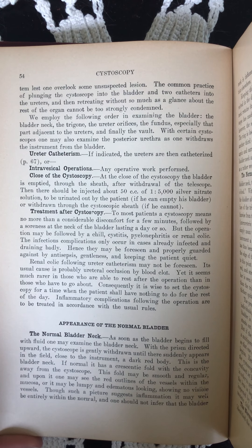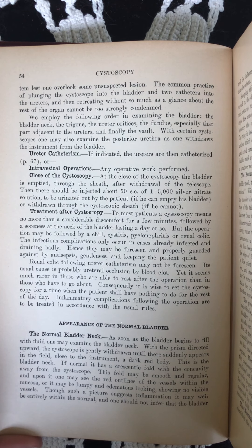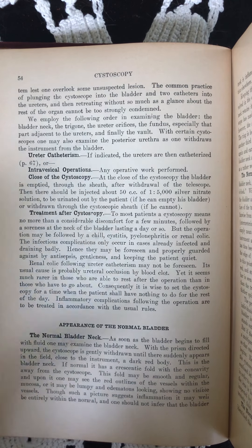Ureter catheterism. If indicated, the ureters are then catheterized, or intravesical operations — any operative work performed.